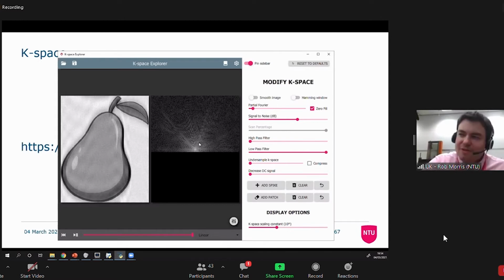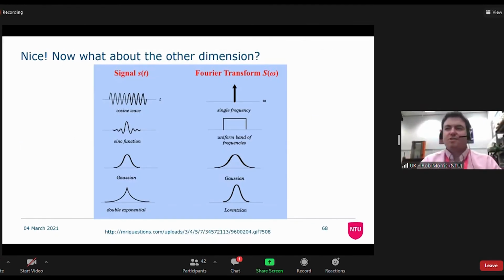There is some magic involved in collecting the important bits of it. And actually there's a whole new branch of MRI opened up in the last 10 years or so of people doing compressed sensing and picking important points within k-space that they know will give them the information which they want, but save huge quantities of scan time. Fortunately for the likes of me, who like to program stuff on the scanner and not do the really hard maths that go with it, they just give you a routine and you stick it on and it works out which points of k-space you should collect and it does it. So we're at that stage very much with compressed sensing, which is really exciting, and it gives us a really quick way to collect images sensibly in whatever directions we want.